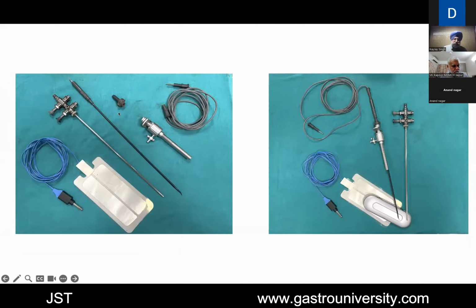If you see the image on the left side, it is just an innocuous collection of our instruments. They are harmless when they are kept like this, independently. When they are articulated like this, presume this gray thing to be the patient. When they are articulated and assembled like this, and this is going to the cautery unit and this is also going to the cautery unit, then this becomes a very, very dangerous weapon.